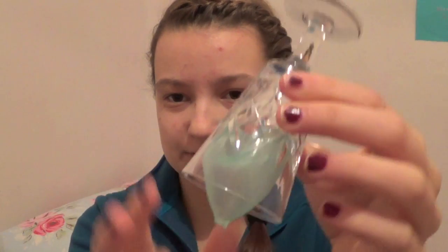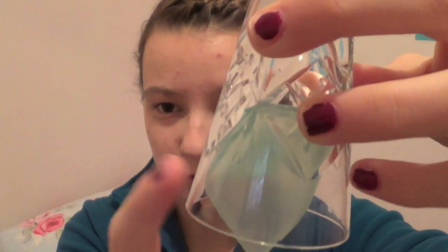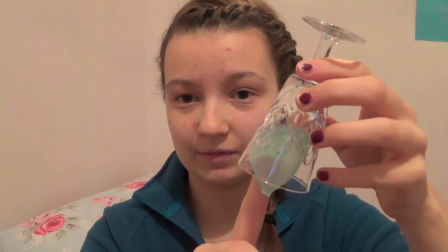Now, if this happens, you can see here that the cup is not quite open, it's still tucked in. This is one of the things you need to check when you first insert your menstrual cup, especially if you're a beginner. The easiest way to do that is literally to take your finger, insert it up next to the cup, and just run it around the rim of the cup.